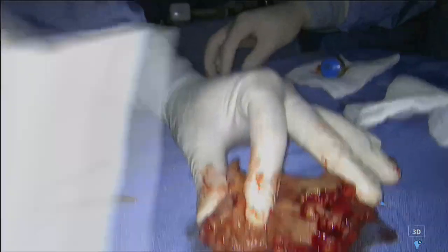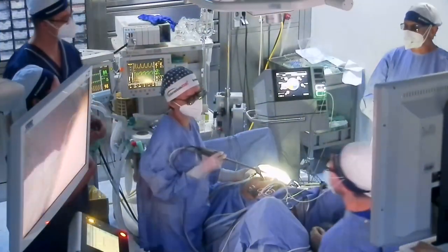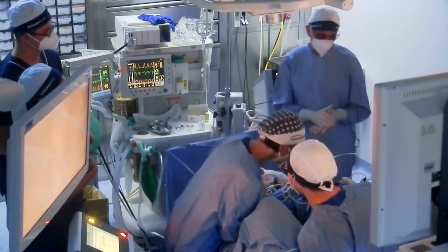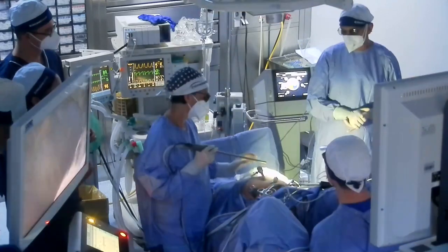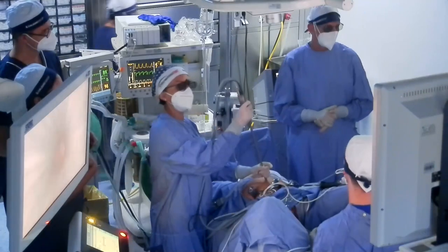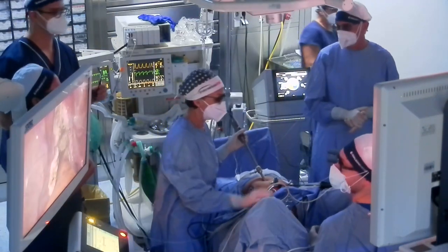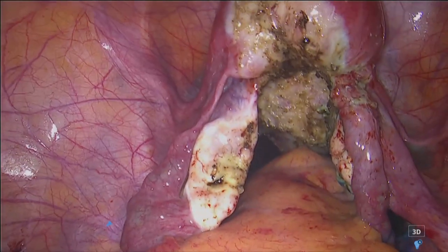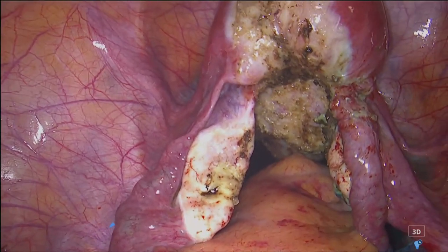So this is important, because in the literature, the IDEA group is an international group of ultrasound specialists in the treatment and evaluation of endometriosis, and they describe a different kind of evaluation of the sites. But we published our results and our technique to do ultrasound, and we believe that this is the right kind of evaluation in order to avoid underestimating the size of the nodule.